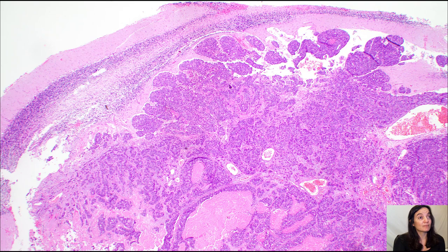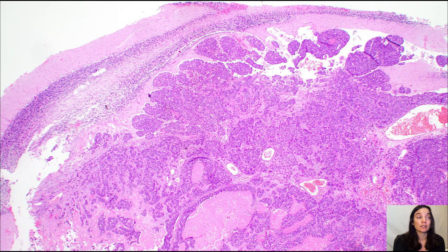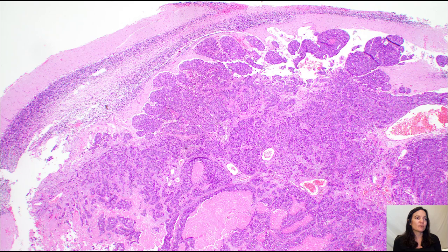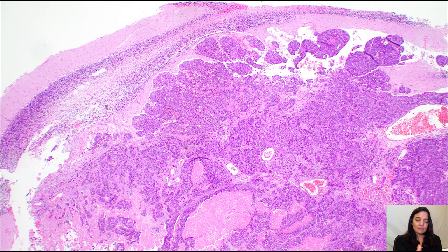This lesion here is pretty bad-looking. This grungy pink area is necrosis — necrosis here, necrosis here, necrosis here — so this is a really bad-looking tumor. Notice that the border between the tumor and the non-neoplastic brain tissue is very well delineated. In a diffuse glioma or most other primary CNS lesions, that border is going to be much more diffuse. Even circumscribed gliomas like pilocytic astrocytomas, PXAs, and gangliogliomas — which are characteristically circumscribed — will still have a little infiltration into the surrounding non-neoplastic brain tissue.